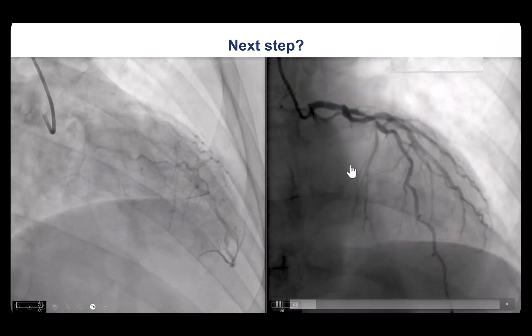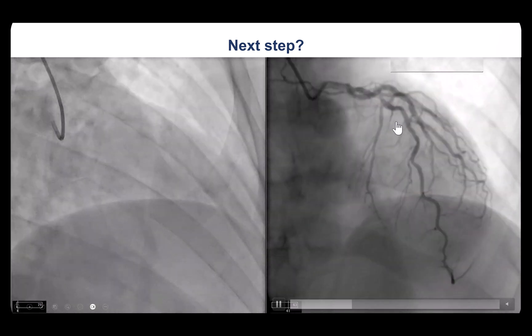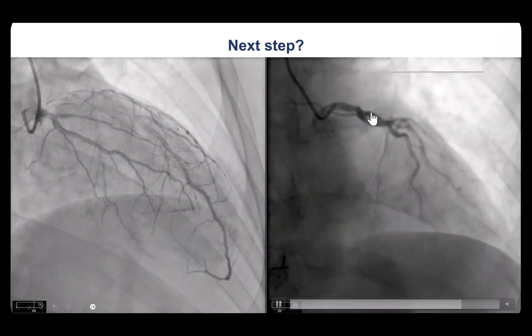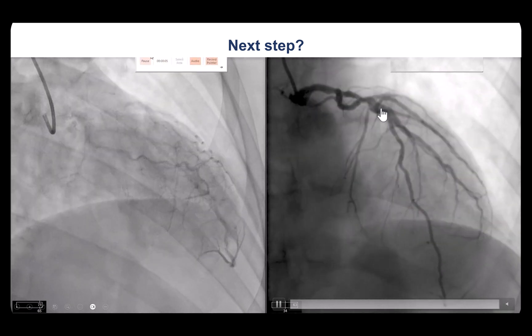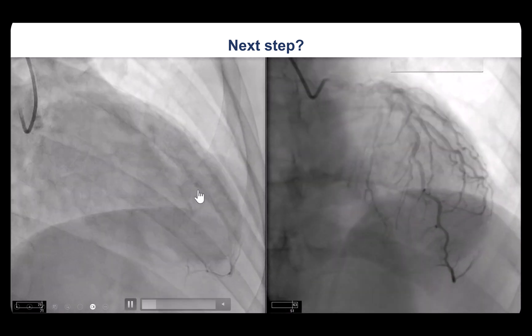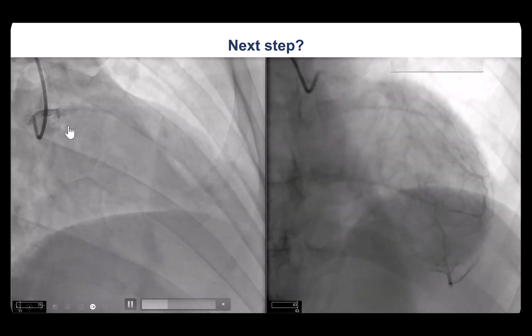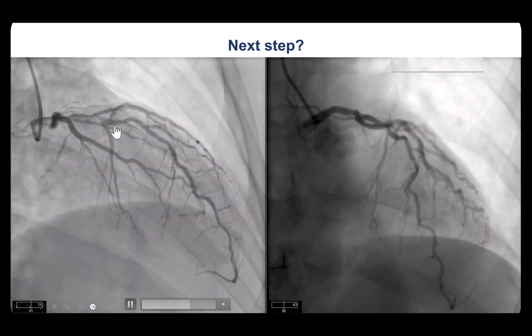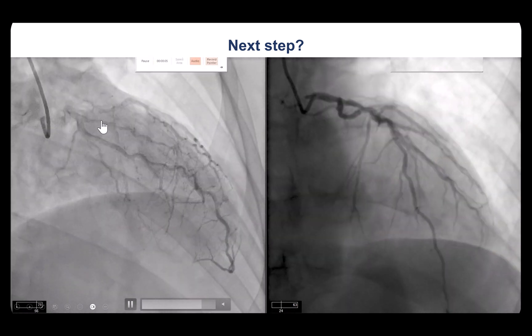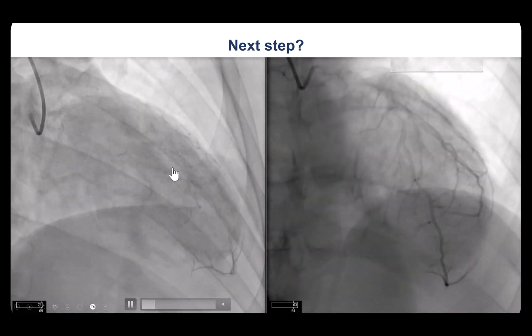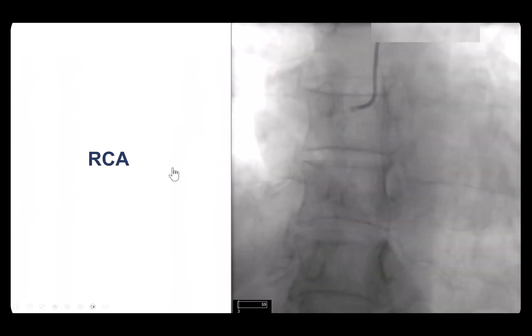This is the coronary angiogram. A caudal view shows a significant lesion in the mid-LAD right after the takeoff of a diagonal branch. There is some disease in the circumflex that does not seem to be occlusive. The same LAD lesion with moderate disease in the circumflex was confirmed with different views. In the cranial view, we see that the lesion is hidden behind the circumflex due to overlap, and we can see the lesion also in the cranial view as well.